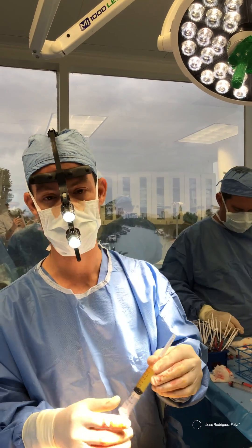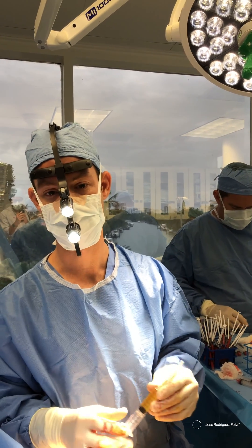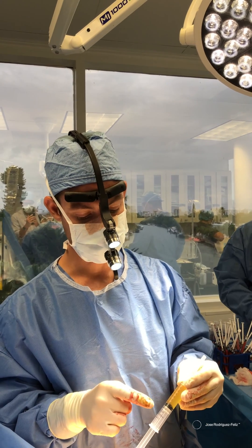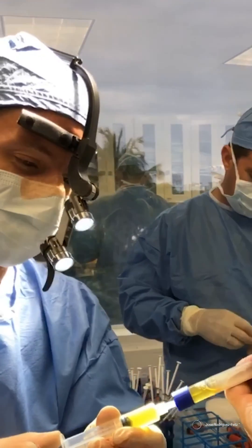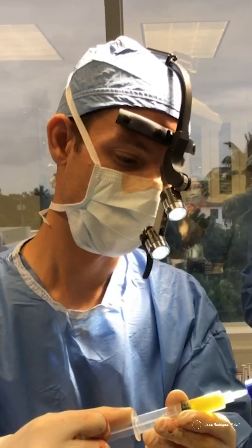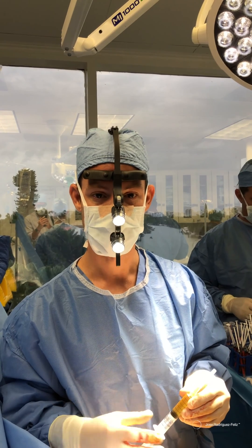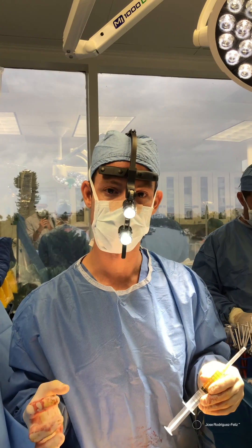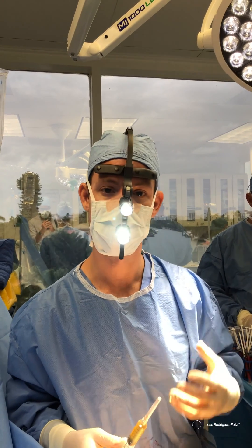I have here PRP, which is platelet-rich plasma. We drew some blood before her surgery, spun it, and all the platelets have been concentrated in this yellow fluid. We're going to inject this into the tissue where the fat grafting will be placed, and this is going to help the blood vessels get into that area faster, aiding the survival of the fat grafting.